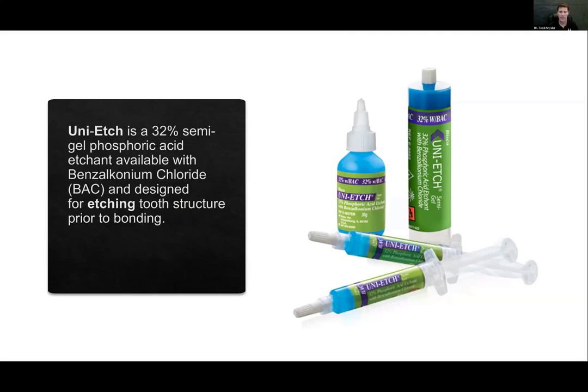And you think, well, yeah, an acid, right? No, phosphoric acid does not get rid of or kill the bugs. Might wash some away, but it's not killing them. Now, Bisco took the time to say, hey, let's put some benzalkonium chloride in there. That will kill bugs. So then we're less concerned about contaminants on the tooth structure, right? So well thought out to add that in there.